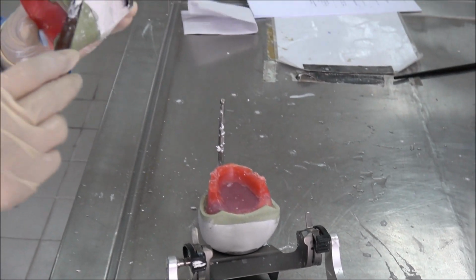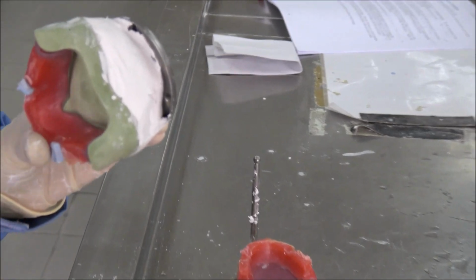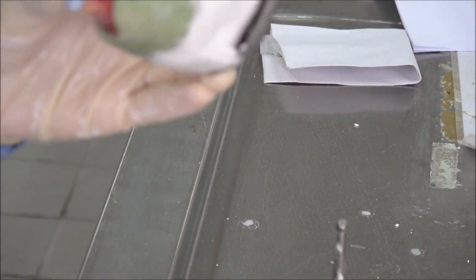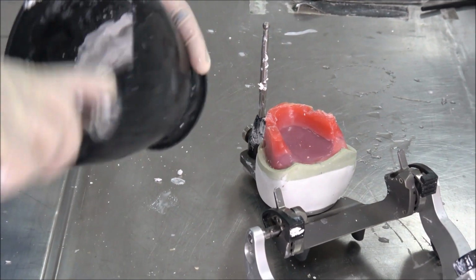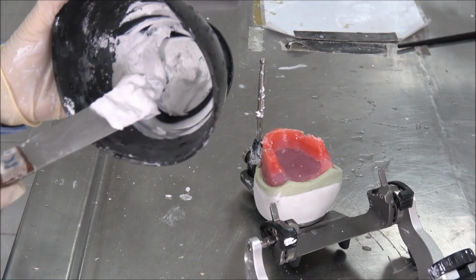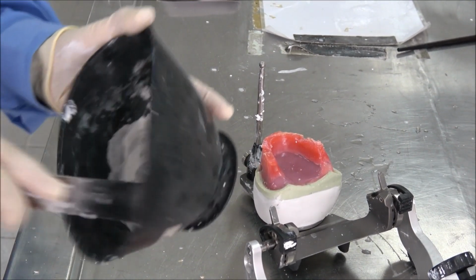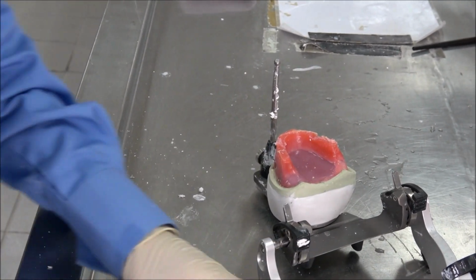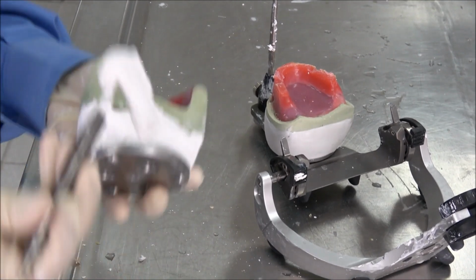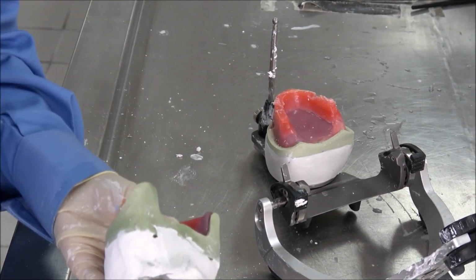Okay, there is some gap here. Okay, it's okay, never mind. We can add on now. Okay, so we just make some POP. Make sure you don't mix too much, just a little bit. If not enough, you only add on. So we just roughly make it, and then we can add now. So we just touch it up. You just add on, make it nicer.